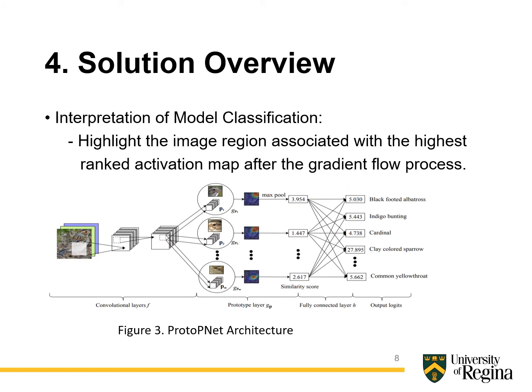The class activation maps obtained from the final convolution layers in the CNN architectures are the main contributors of the decision classification in the network. An activation score is obtained by gradient flow backpropagated from every perturbation in the activation maps of this layer during the training. Interpreting the model classification is done by observing how much every activation map contributes to the final classification of the model. Hence, the input image regions corresponding to the ranked activation maps help in interpreting the region of interest for the final classification made, as shown in the below figure.